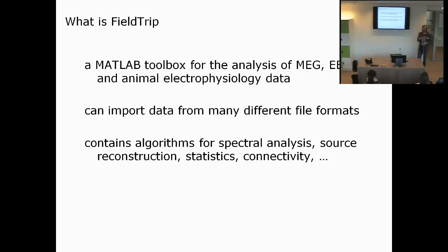FieldTrip can analyze data from many different file formats, from many different acquisition systems, and the toolbox contains algorithms for spectral analysis, for source reconstruction, statistics and connectivity, and all sorts of things that you need around it.